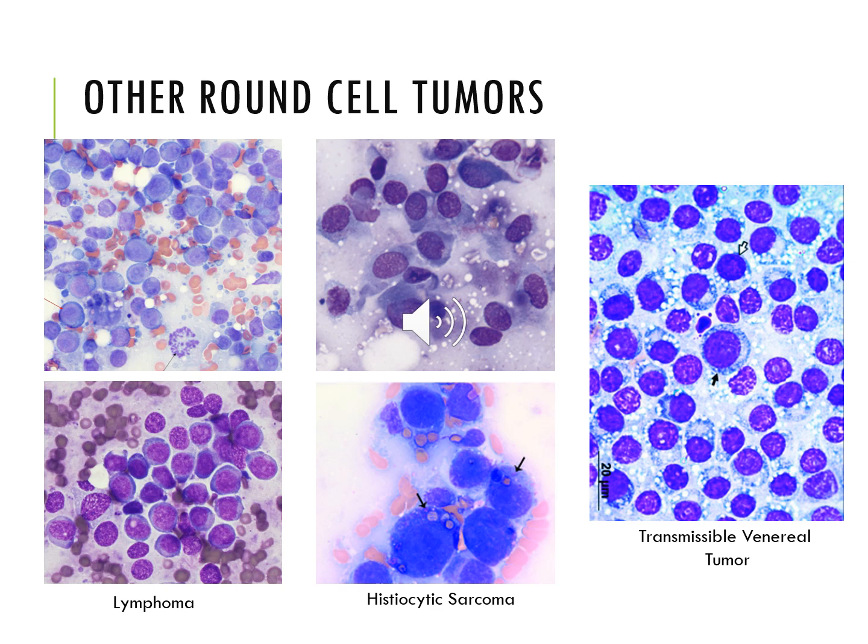So I just wanted to, again, point out that there are some issues with Diffquick, and if you guys have a hard time diagnosing lymphoma in practice, feel free to submit unstained slides to us, and we'd be happy to read them out to see if we can maybe assist. So just wanted to point that out.